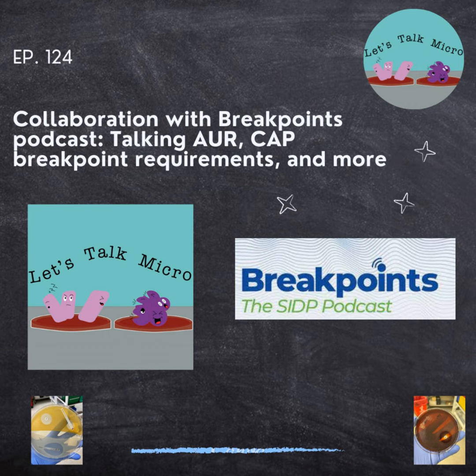So the best process is to treat the whole process as validation instead of verification. In a way, you don't have to pinpoint a specific combination, but you just treat all of them as a validation. They fulfill the verification process for the FDA. Moving from the FDA to any other breakpoint requires a validation, because we're technically modifying an FDA-approved method. And this validation process starts with identifying, if it's an equipment or process that you already have implemented, what is the antimicrobial that has the breakpoint updated, and what are the organisms that will be affected by this new update.